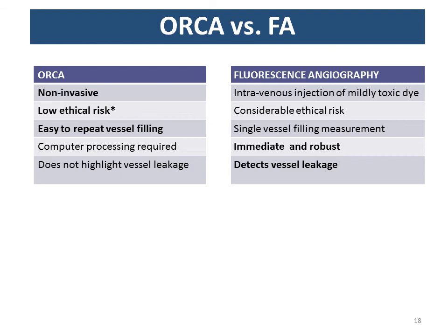Subjects experience almost no feeling of lightheadedness at all. We had 11 subjects, and maybe 2 or 3 reported feeling lightheaded for a very short amount of time, 2, 3, 5 seconds, something like that. But it was nothing compared to the lightheadedness some people would feel with more sustained acute mild hypoxia. So it seems to be low risk, but of course you haven't proved that clinically yet, so asterisk there.